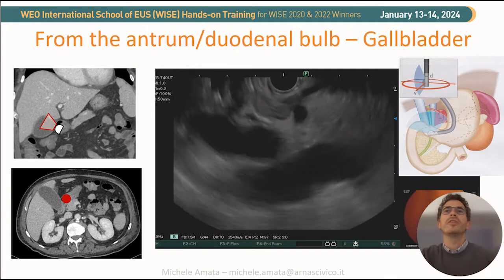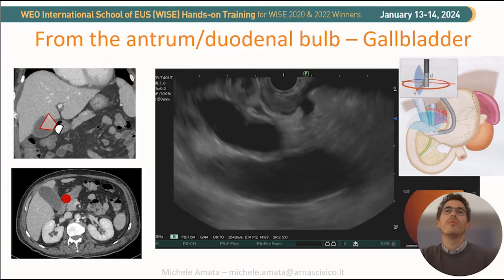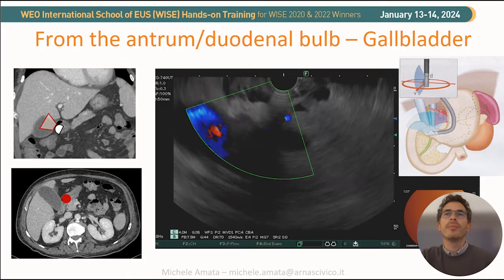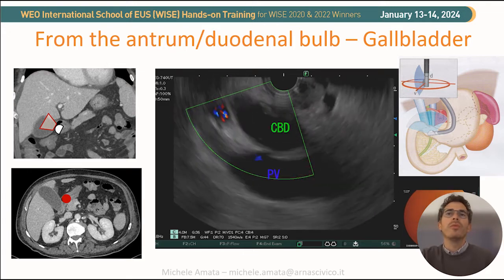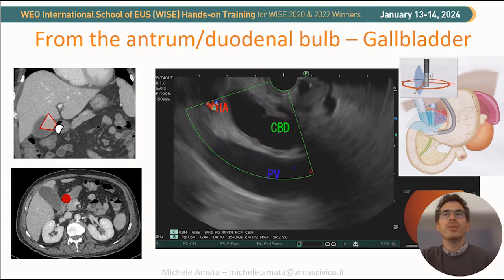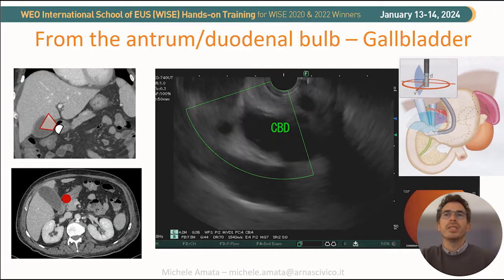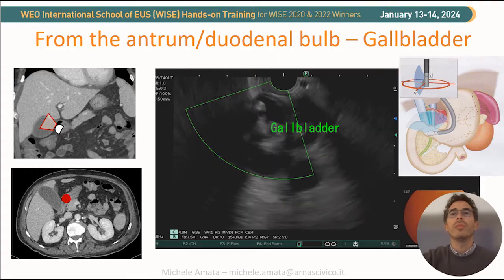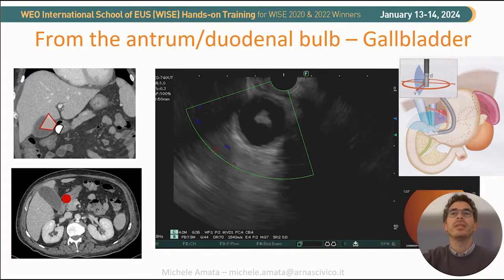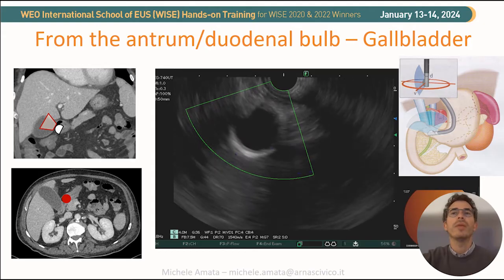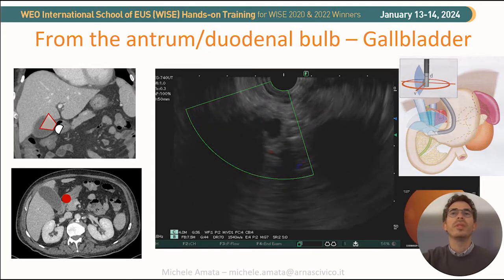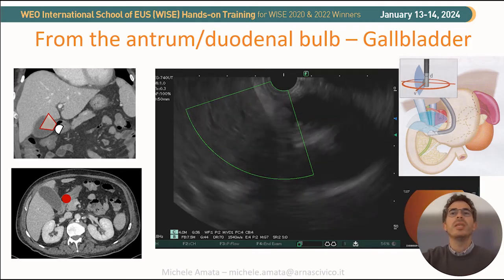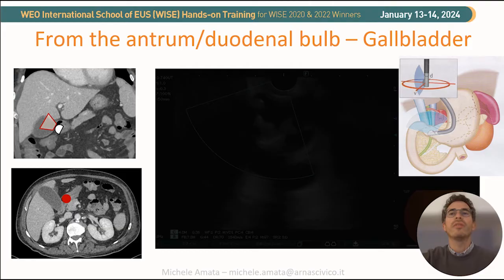After finishing exploring the stomach, we can move to the duodenum, but it is important to see the gallbladder from the antrum. In my personal experience, I always look at the US when directing to the bulb and take a few seconds to find a good US view and simulate a gallbladder drainage, because the position and size of the gallbladder are not always standard. In this case, we have a dilated CBD and multiple stones inside the sclerotic gallbladder.